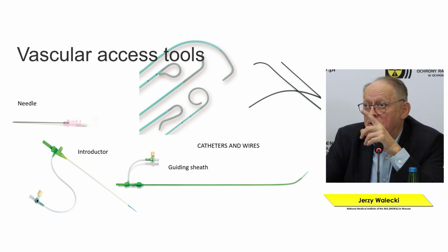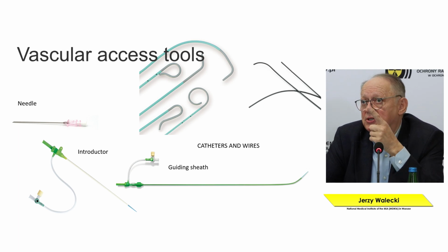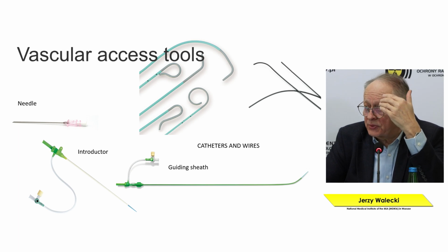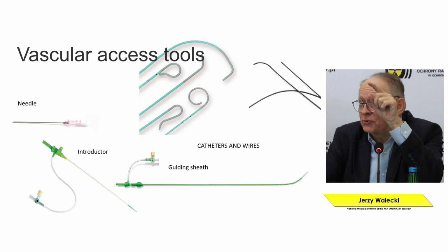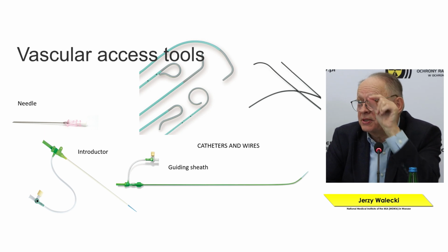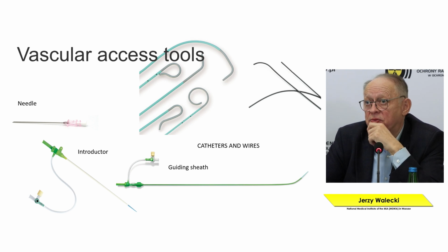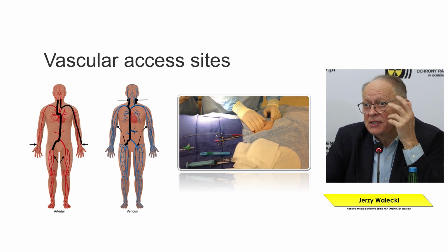Needle, introducer, catheters, and wires, which allow us to, the catheters are sometimes very, very thin, very selective for procedures performed in the brain, where we introduce a balloon, or this is our bread and butter for interventional radiologists.